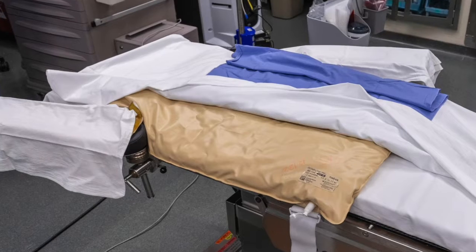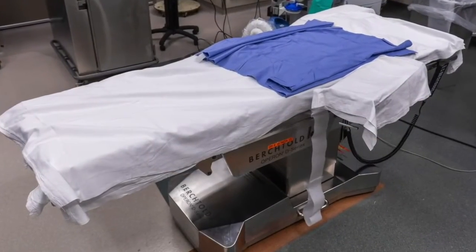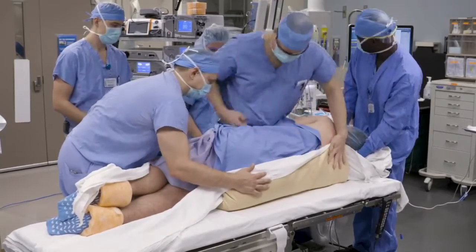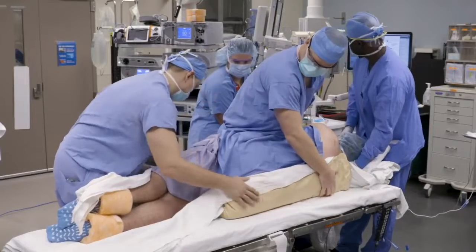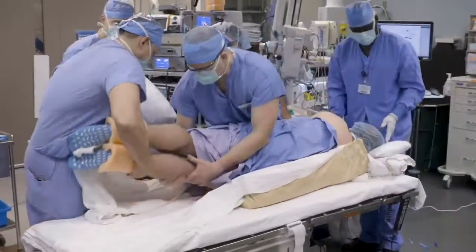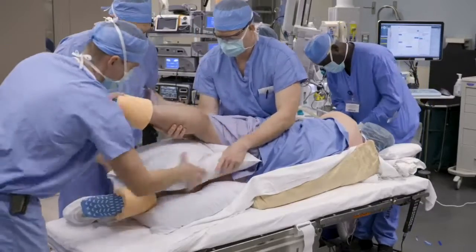A beanbag is placed in the center of the table and then covered with sheets. Once the patient is asleep, they are flipped to the lateral decubitus position and centered on the beanbag. The sheets and beanbag are positioned so that the beanbag is at the medial border of the scapula. Air is evacuated from the beanbag so that the patient is held firmly in place throughout the case. An axillary roll is placed to prevent injury to the brachial plexus. Pillows are positioned below the down leg and between the knees to pad all bony prominences and potential areas of nerve compression.